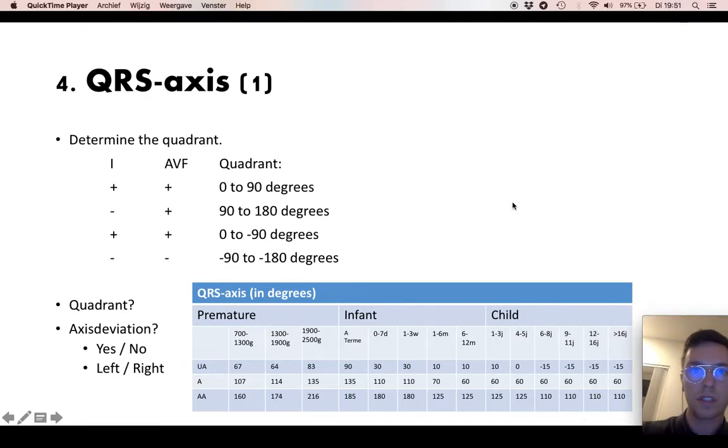For example if you are looking to a child of one to three years the average axis will be 60 degrees, under average will be 10 and above 125. So 60 degrees would be positive in lead I and positive in AVF and then it's completely normal.